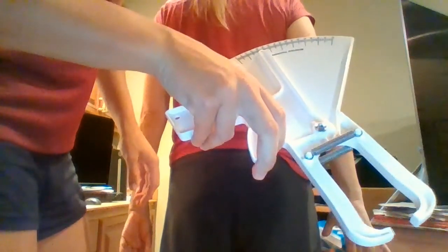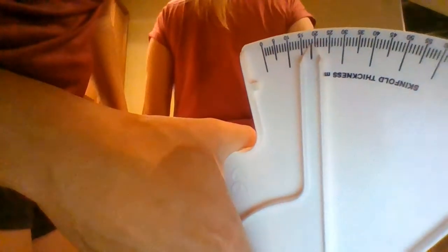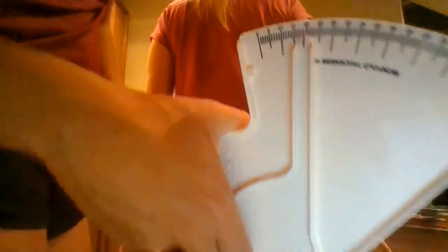Just having her squeeze her tricep to make sure that I'm not grabbing any of that muscle. And I'm going to be putting that right on midline. And that measurement is right at 20. So it was sitting right at 20 on the skin fold caliper.